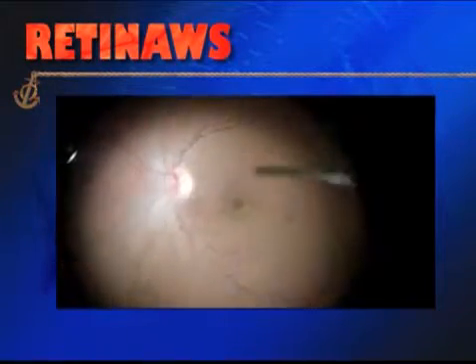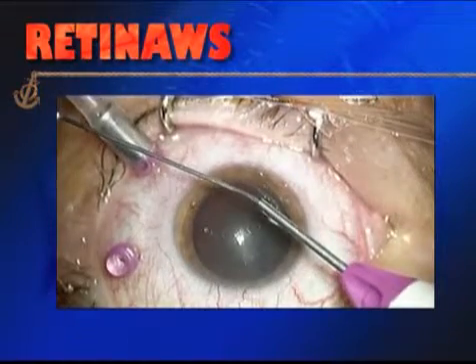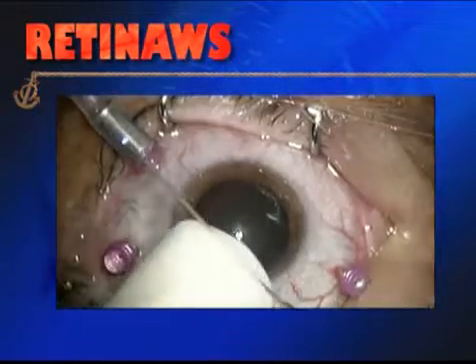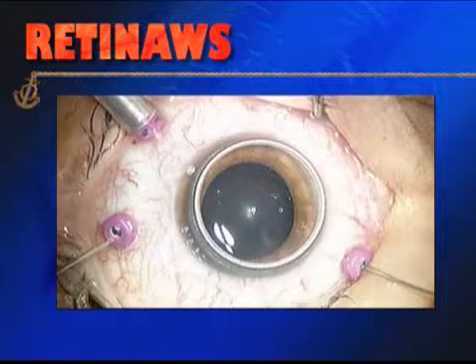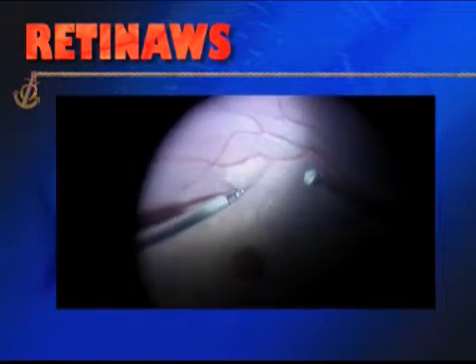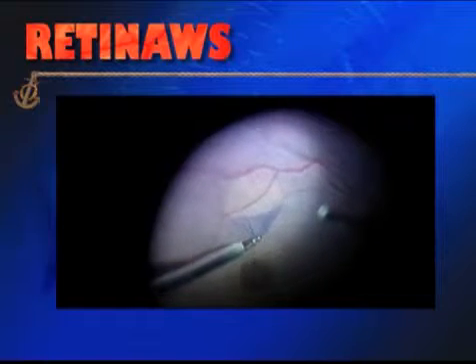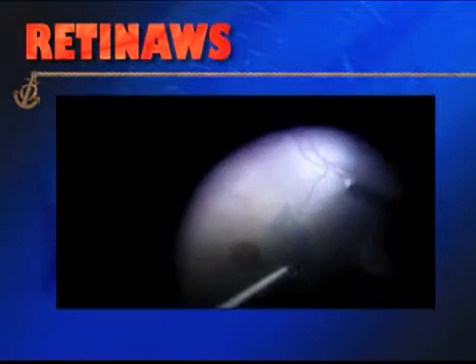No difficulties creating PVD, you see, the Weiss ring there. Expansion of the PVD and peripheral vitrectomy made the cutter bend, as you saw. And then I inject the dye and started to peel with the 27-gauge forceps, which are magnificent. They're very accurate. They grab exactly where you want to grab.